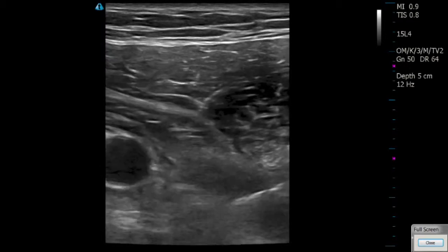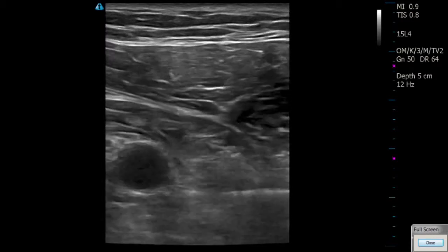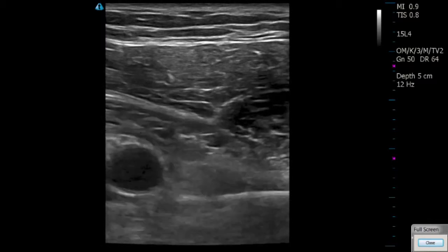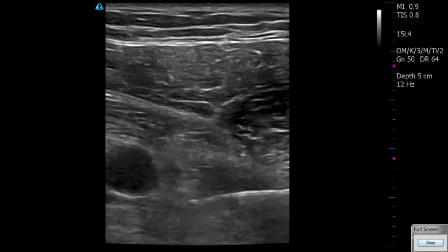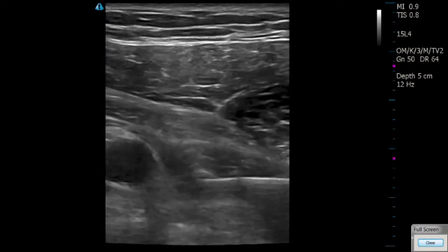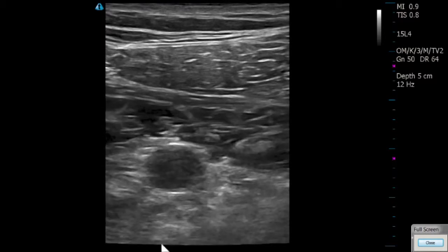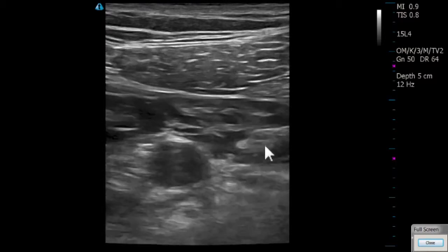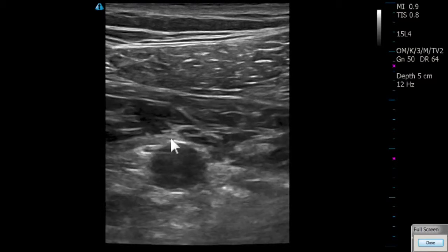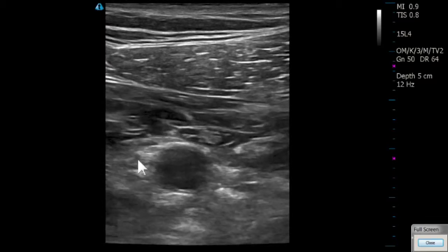As expected, a little bit deeper than the usual position, I'm eliciting a twitch — a little biceps twitch. We'll get the last five cc's there adjacent to the lateral cord. You can see it pushing up on the lateral cord there. We'll get one last picture for billing purposes. You can visualize the posterior cord at about the six o'clock position. Now that there's local anesthesia around it, you can visualize more clearly the lateral cord at the two o'clock position and the medial cord more clearly at the ten o'clock position.